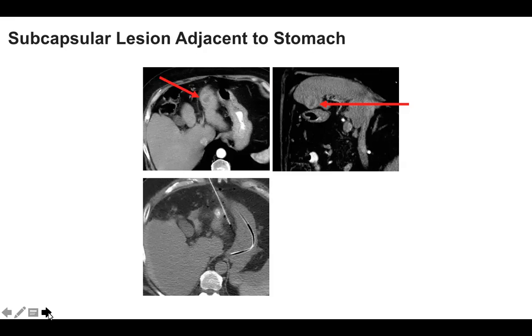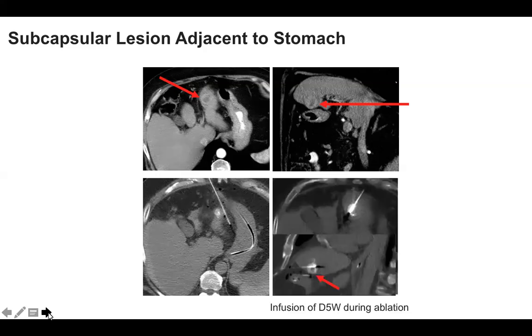If you're able to create that buffer where you want the ablation to be, but it tends to diffuse away, then what we do is simply push in the hydrodissection fluid throughout the ablation, nice and slowly through a large syringe. We just gradually infuse the hydrodissection fluid, and there you can see the tip of the hydrodissection needle just gradually pushing the fluid around that margin.